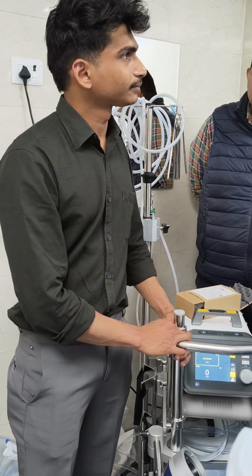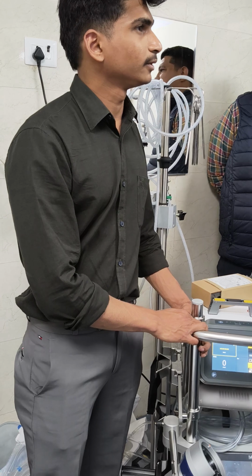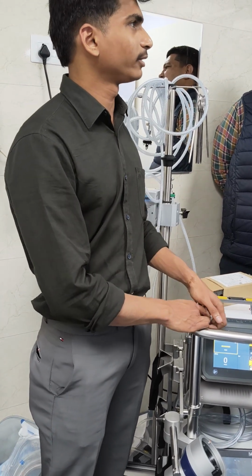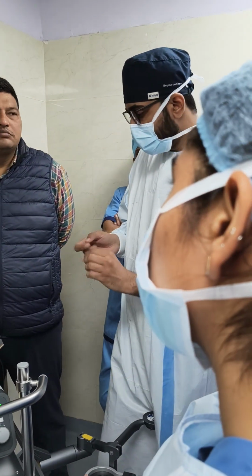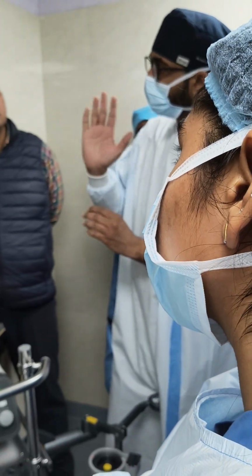And if I have switched on the intervention mode, then does it do it automatically? No, at that time it will only show the interventions. I'm not getting what you are doubting. My question is, does this console intervene, or does it just show the intervention alarm?